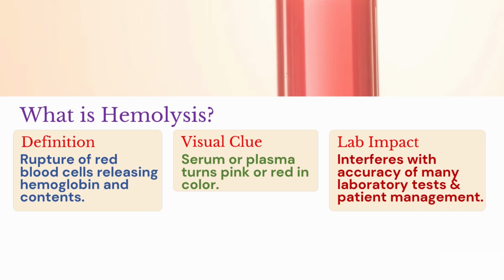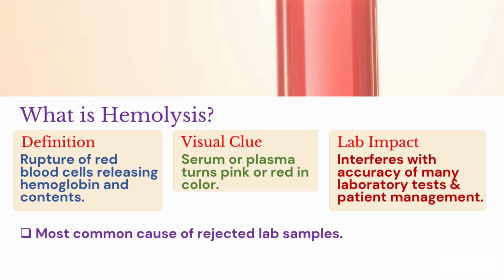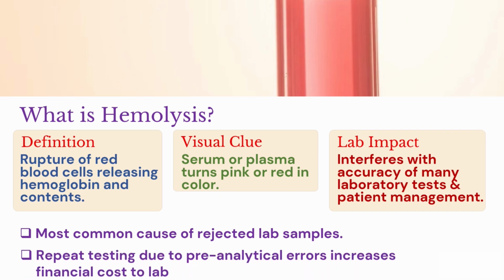And what impact do hemolyzed samples have? They interfere with the accuracy of various laboratory tests and overall patient management. Also, hemolysis is the most common cause of rejection of lab samples, and repeat testing due to these pre-analytical errors increases the financial cost to the laboratory.